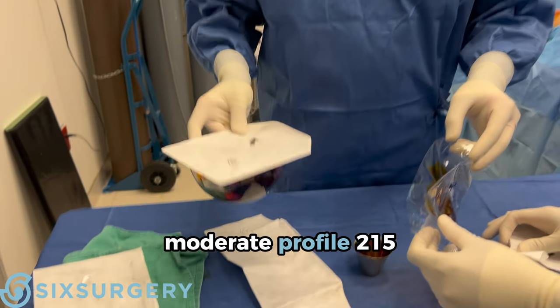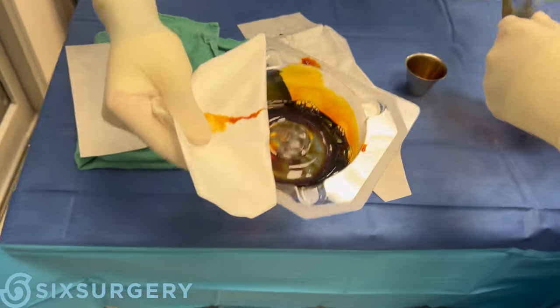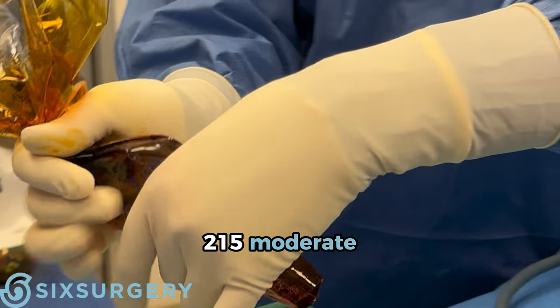So these are moderate profile 215 implants. Check it — that's exactly what it's supposed to be: 215 moderate.